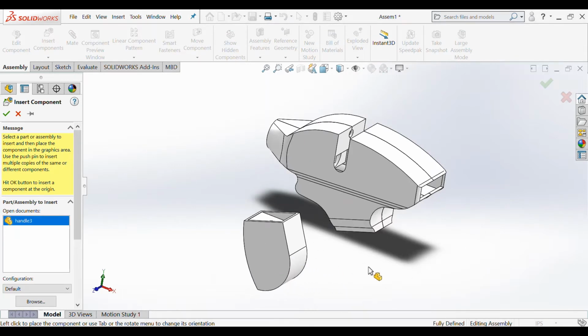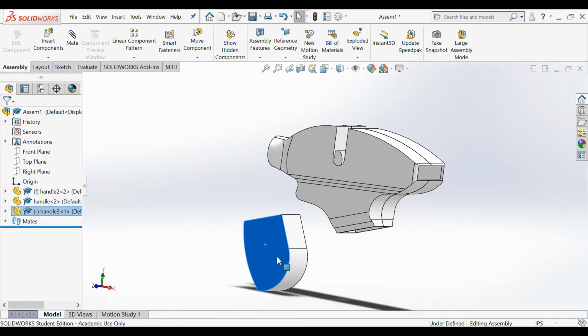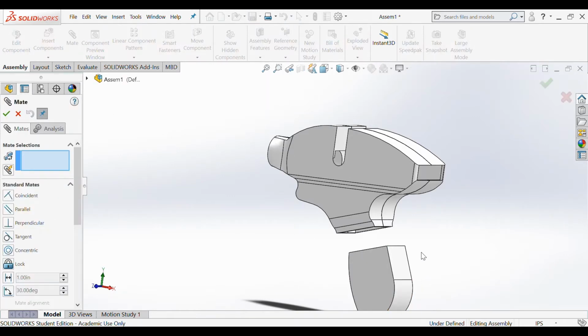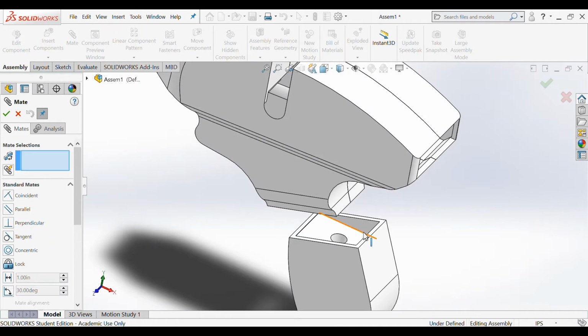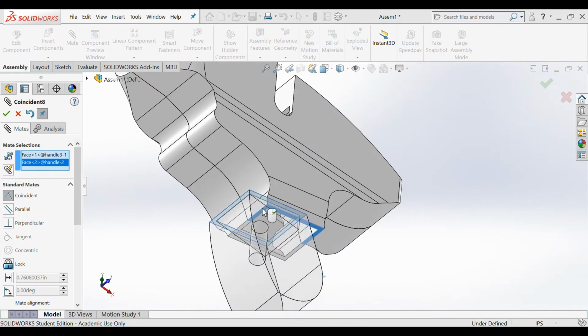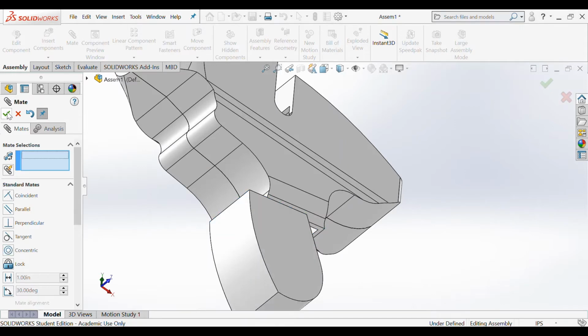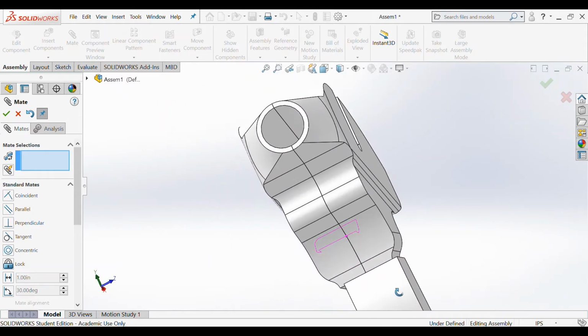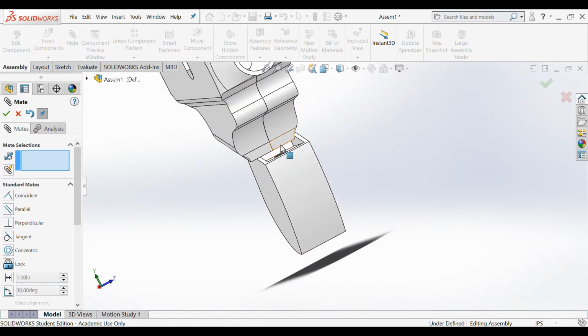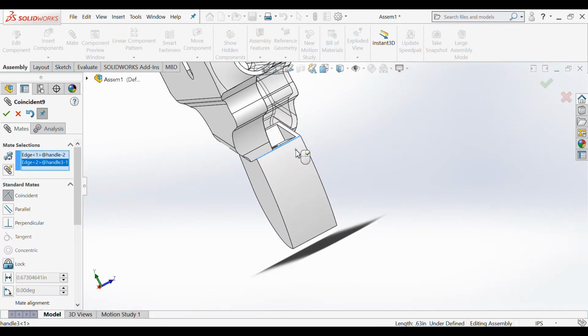I'm going to click, and so to mate these two parts, I'm going to click on mate, and I'm going to click on this top face right here, and the bottom face made by the two handle pieces, and I'm going to make them coincident. And then I'm going to zoom out a little bit so you can get a better view. I'm going to click on this edge right here and this edge right here and make them coincident.